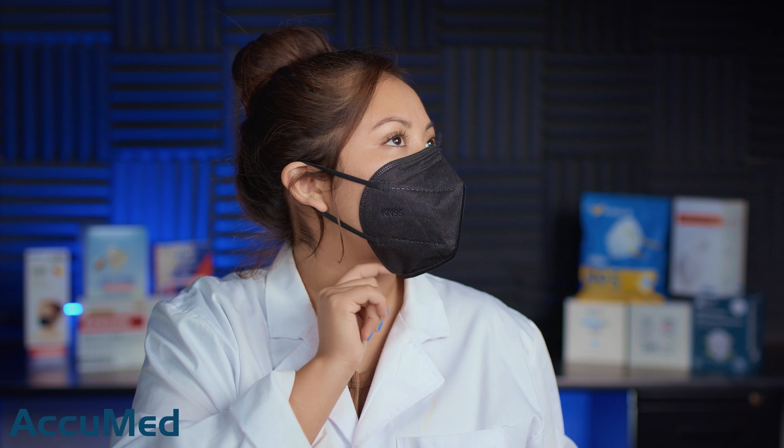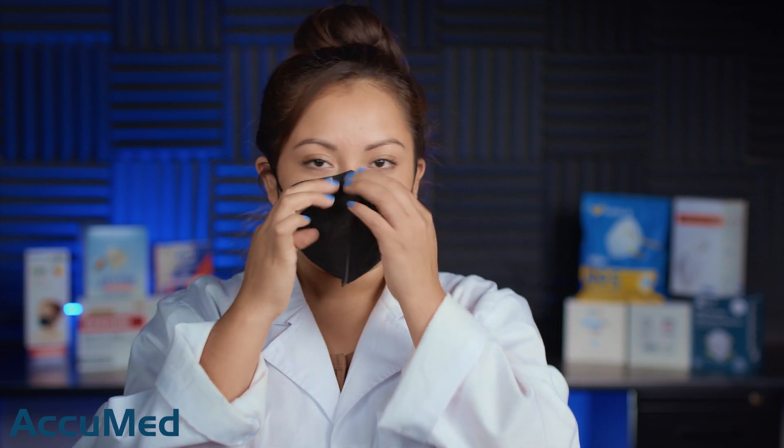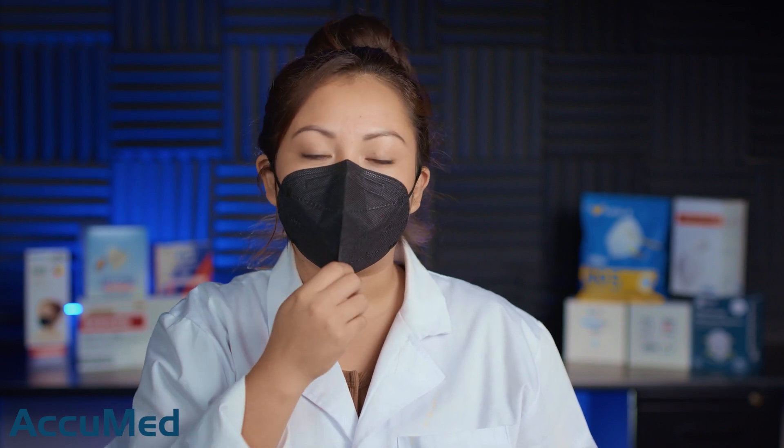I am getting quite a bit of leakage down here. I'm not getting a good seal right under the chin, so there is some leakage there. They are actually a very comfortable K95, but they do have a very strong chemical smell. If you are sensitive to strong smells, you might not like this initially, but the smell will go away eventually.